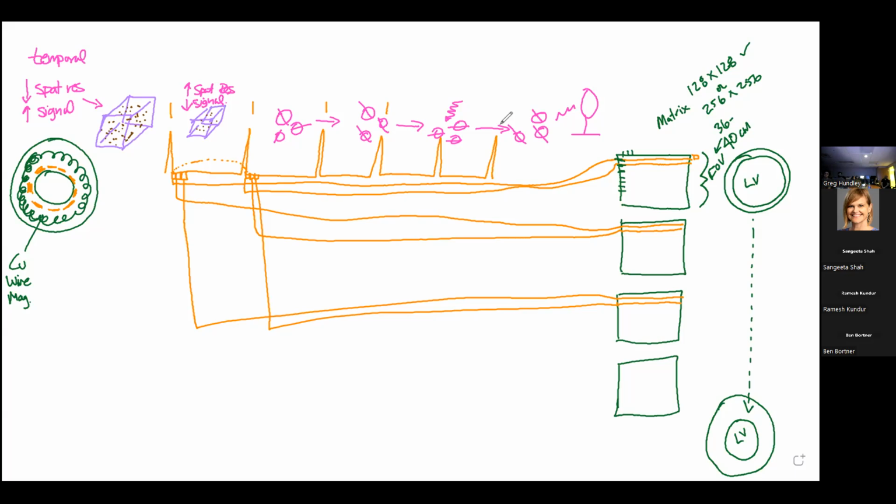What that allows you to do, if we've got a little more oomph in these gradients and can switch them quicker, is really shrink the time of these little boxes right here. The time interval that you're going to hear is called the TR. This little box can be shrunk down to, gosh, I don't know if Dr. Grizzard's here, 6 milliseconds. That is a very, very short period of time. Not a lot happens in 6 milliseconds.